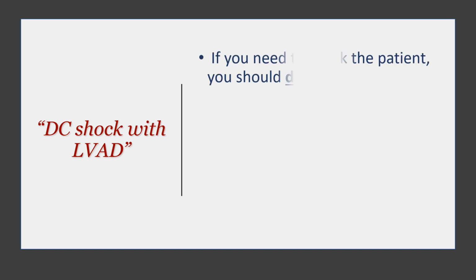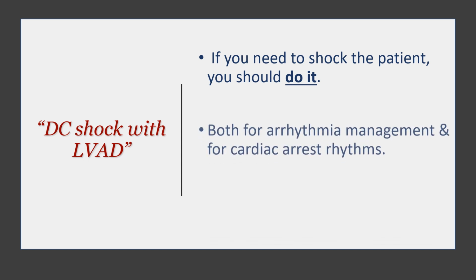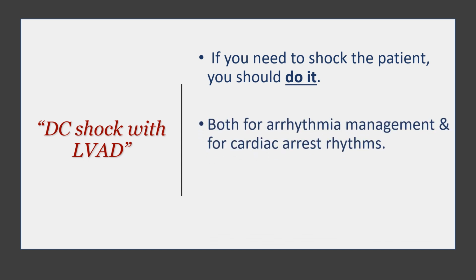And finally, DC shock with LVAD. Can we do it, or are there concerns here as well? Well, actually, you can just do it. If you think that your patient needs a shock, then you shock them. So that applies both to cardiac arrest rhythms and to dangerous arrhythmias. So basically, just treat this patient like any other patient who's got a pacemaker in place.